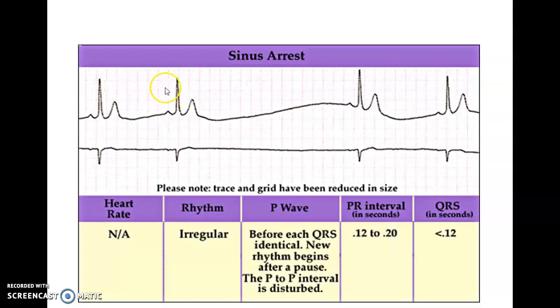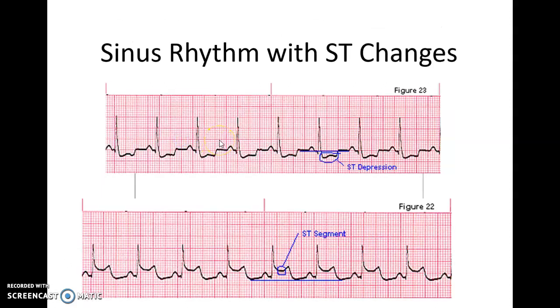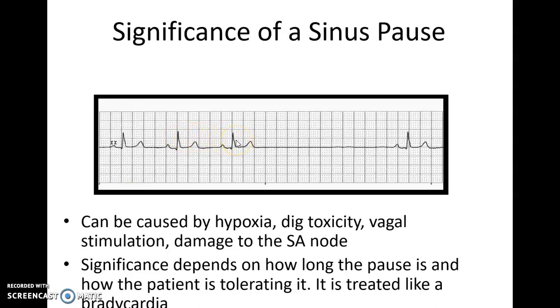On this next strip, it looks like I have a regular rhythm from QRS to QRS, and then I'm missing some beats, and then it looks like the rhythm picks right back up. If I just looked at this strip I would say I have a sinus bradycardia at 40 — but that's really not what's happening. If I had seen the longer strip, I would have seen R to R to R to R being regular until I got to those beats that were missing. This portion probably represents about a three-second strip, so the underlying rate is about 60.